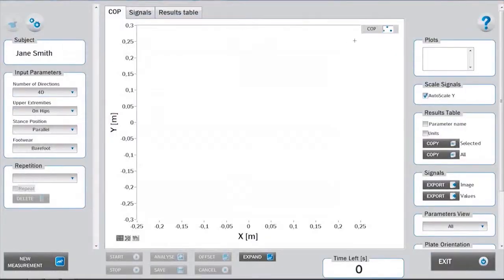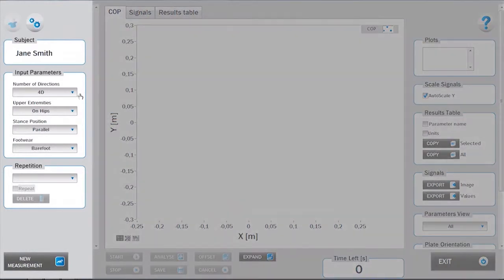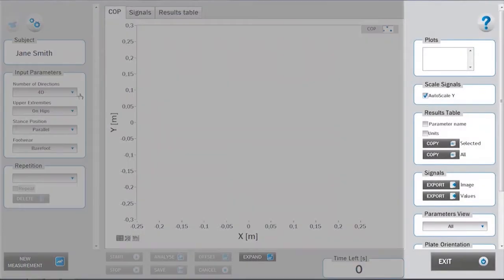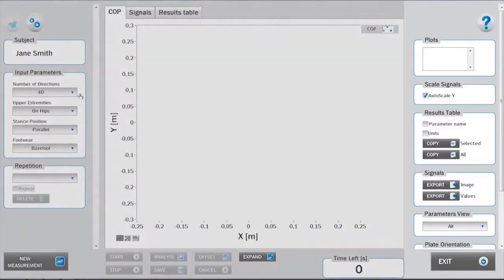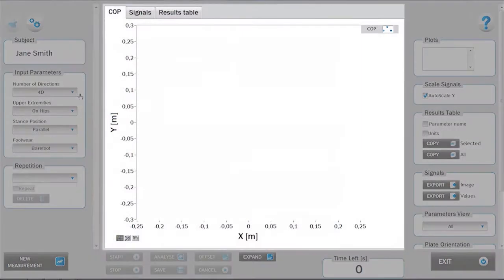Consistently with the organization of all the MARS test modules, the interface is divided into a left setup panel, a right analysis panel, a bottom measurement panel, and the central signals and results area.